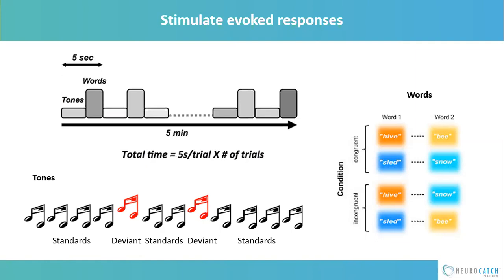get a larger N100. So if we look at the red tones themselves, when it's much like when you hear, if you're in the woods and you're walking and a stick snaps and you pay attention. So you hear this louder tone and it creates a louder N100, but it also creates this P300 because it's rare and improbable. And so both the N100 and the P300 come off from the tones. And in general, you need anywhere from 15 trials to upwards to get these, 15, 20.